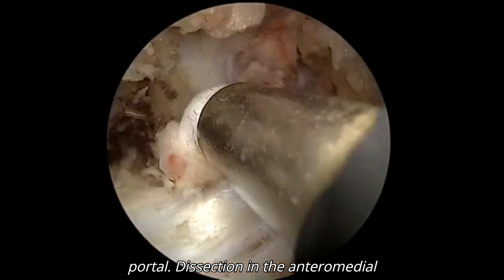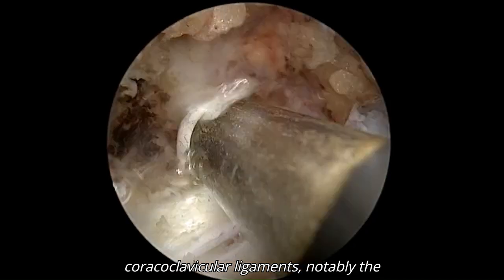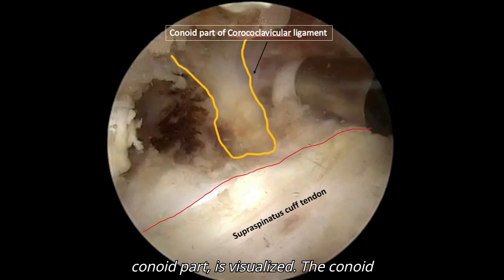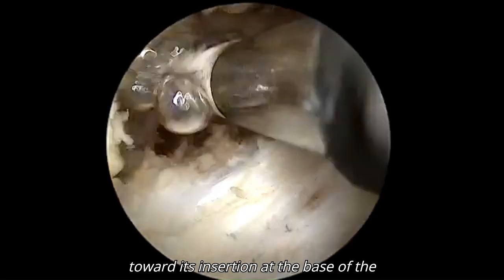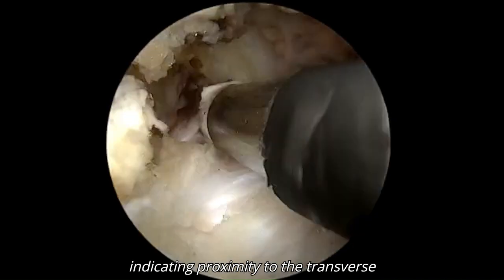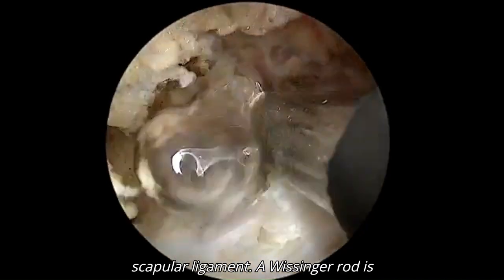Dissection in the anteromedial plane continues until the coracoclavicular ligaments, notably the conoid part, is visualized. The conoid ligament is then followed inferiorly toward its insertion at the base of the coracoid, which serves as a key landmark indicating proximity to the transverse scapular ligament.